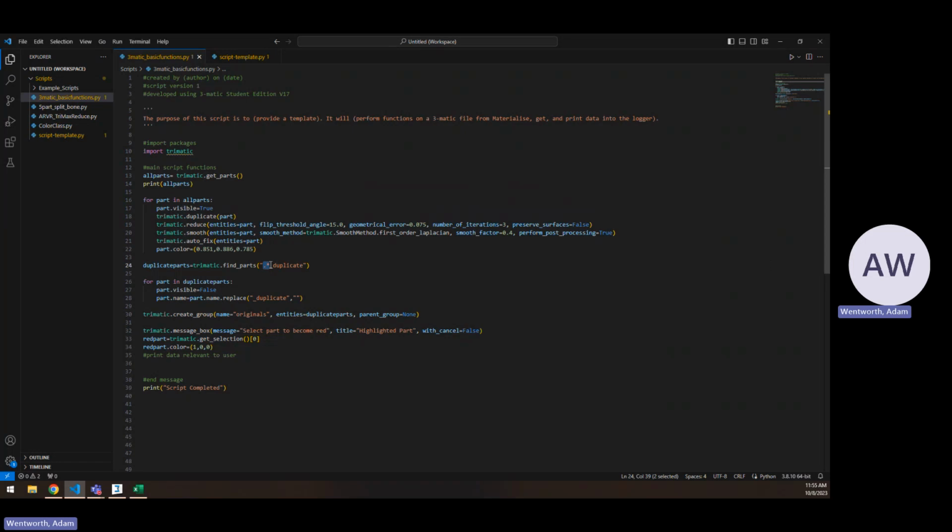This dot asterisk is basically a wild card. Anything could be in this place, but we want to find any part with underscore duplicate in its name and something before it. Given that we don't have regular expression indicated after the duplicate, if you have a part that's underscore duplicate and then some other stuff, it may not find those. Replacing part of a part's name. This is inside a loop, but it could be separate as well. Creating a group, putting a message box up, and getting a selected object. Typically, this would be after a message box so that the user has a chance to select a specific object, and the message box is going to tell them what the object or what kind of object is and what's going to happen to it.